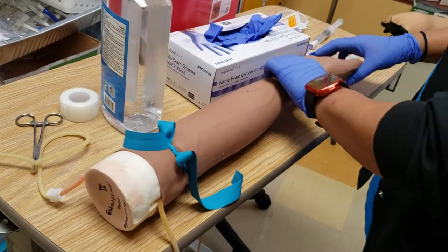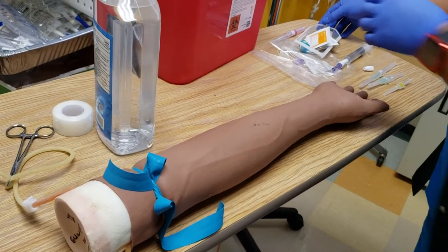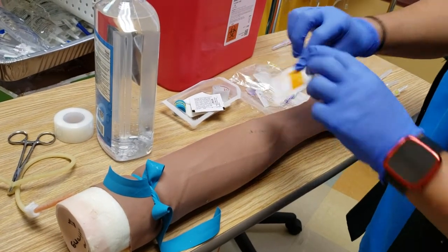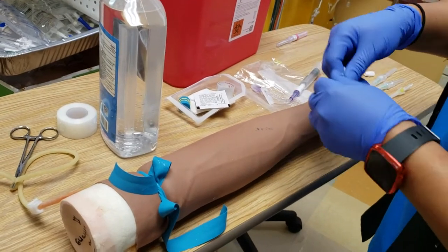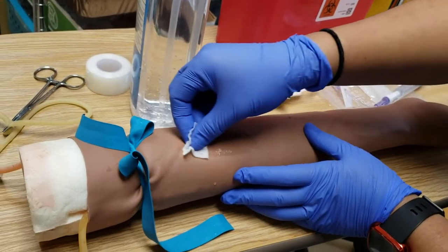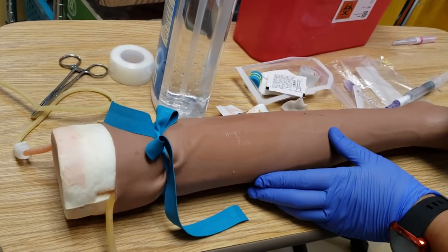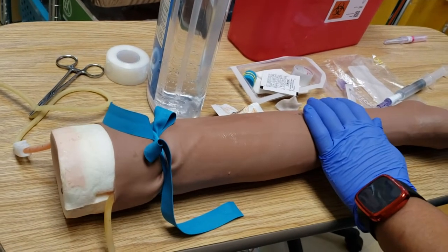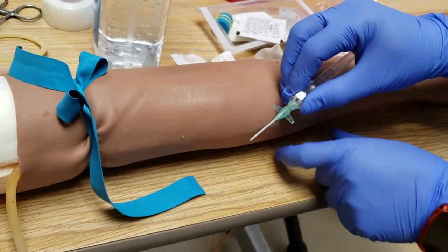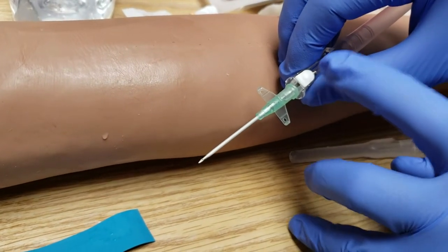I'm going to go for this vein here. I'm going to take my alcohol — what you'll have in the hospital are the rubs; these are the older ones. Scrub and then go around. Give it a few seconds to dry, then I'm going to take my needle. You want the bevel to be up. If you're not sure if the bevel is up, just look for the button because that button should be on top.